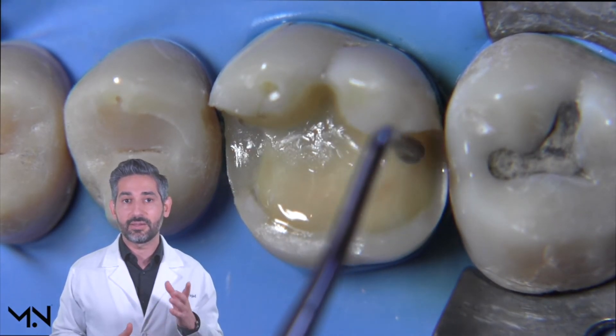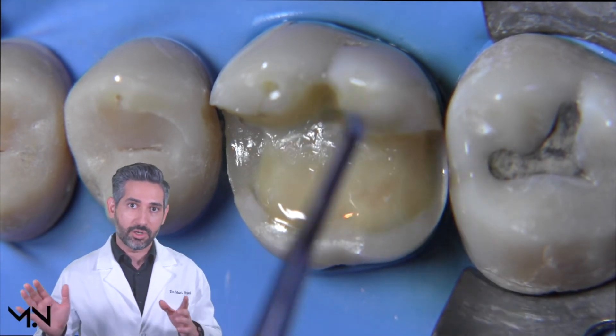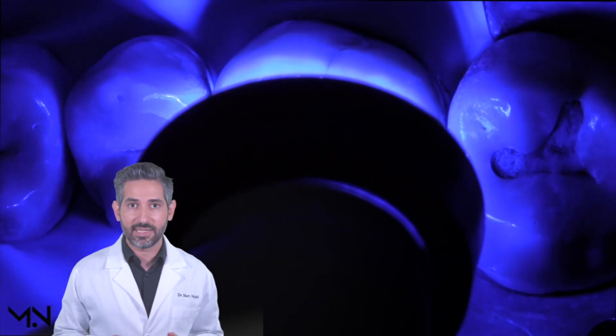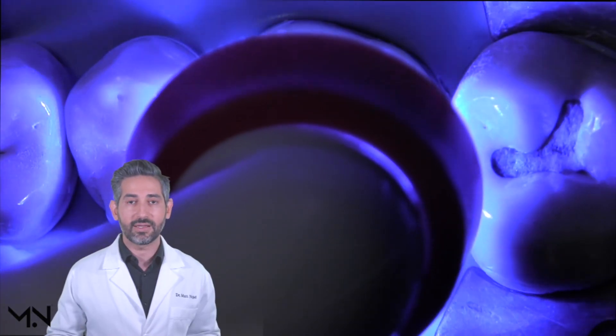As I'm doing this, I'm making sure not to leave any composite on the enamel. I'm just trying to block out the undercut, so I want to clean up the enamel margin as best as I can, and once I'm happy with everything I'll cure this for an additional 10 to 20 seconds.